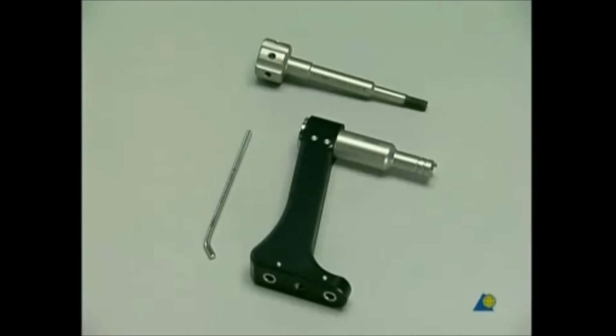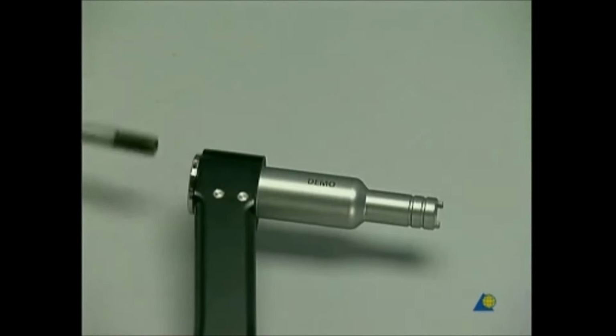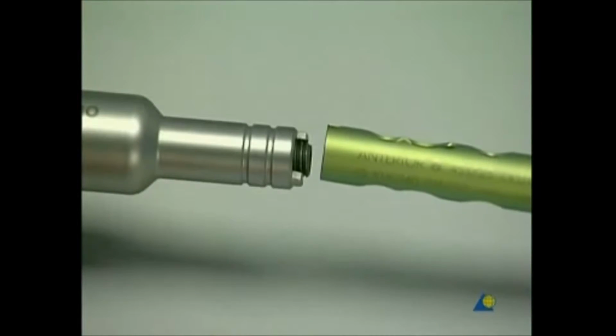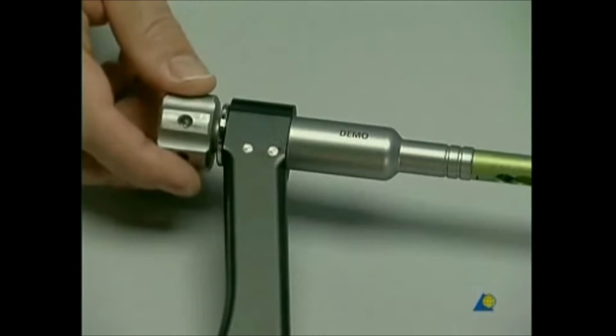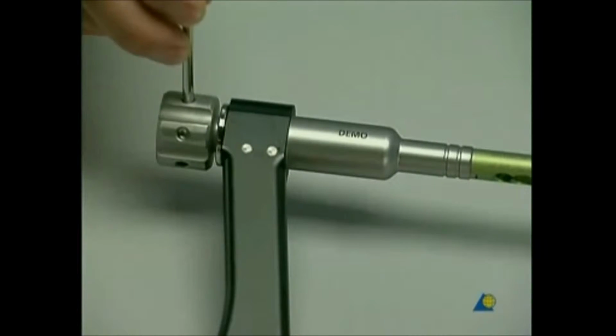To mount the insertion handle onto the nail, the connecting screw and the pin wrench are used. With the insertion handle facing laterally, the connecting screw is inserted, and the teeth on the handle are aligned with the corresponding notches in the nail. The curvature of the implant must be aligned with the anterior curvature of the femur. The inscription "anterior" on the nail helps avoid confusion. The connecting screw is then tightened with the pin wrench.